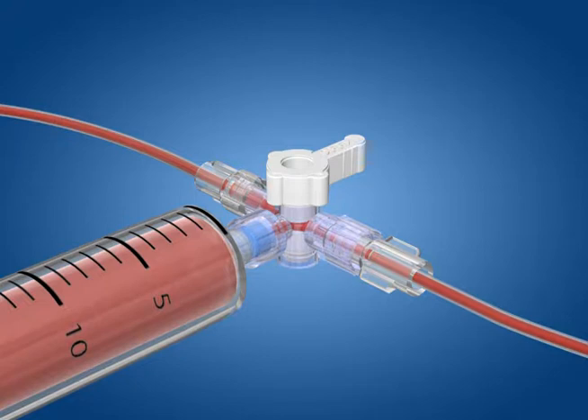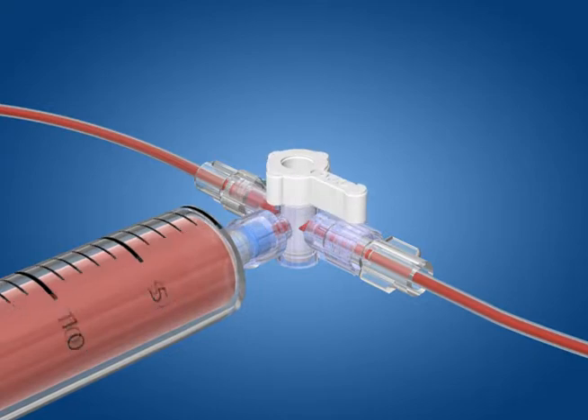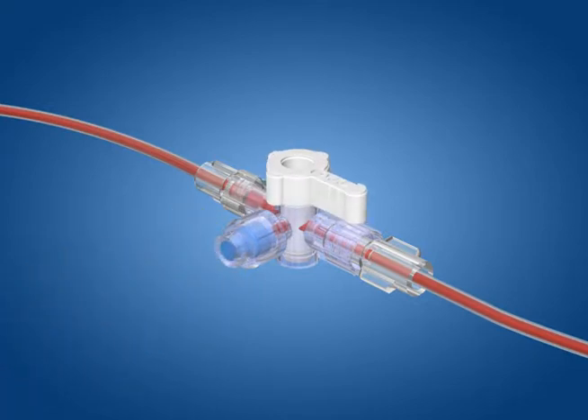Before removing the access device, turn the handle on the swappable valve so that it is oriented towards the valve. It may also be oriented towards the patient connection. Remove the access device from the valve.